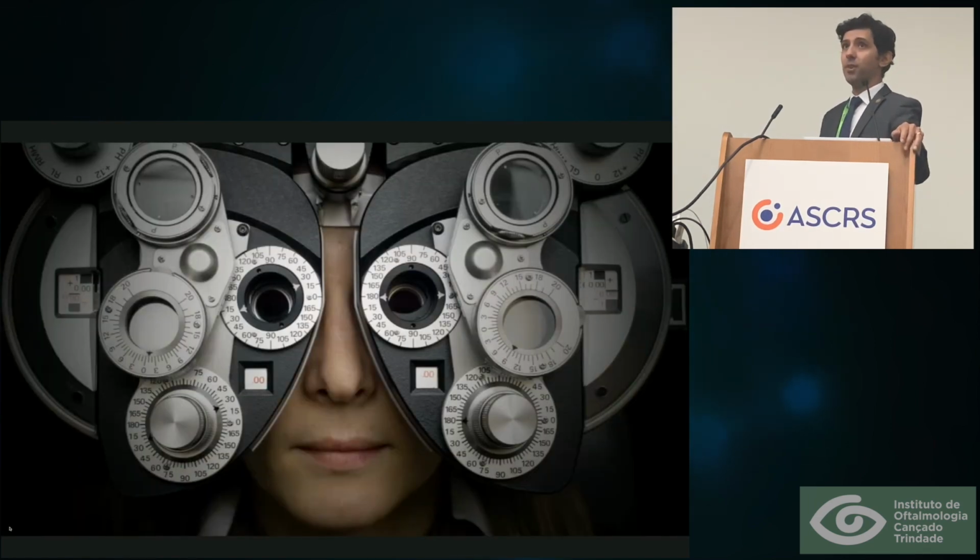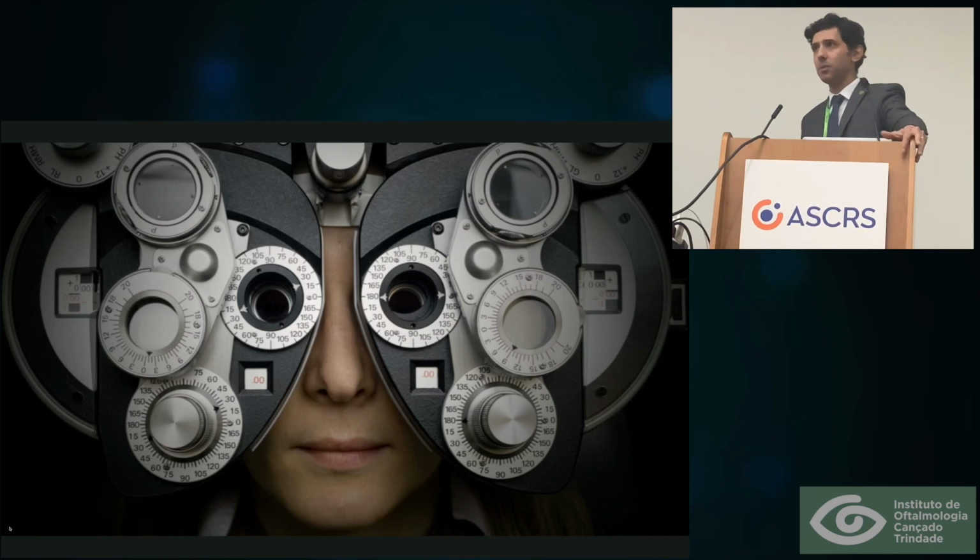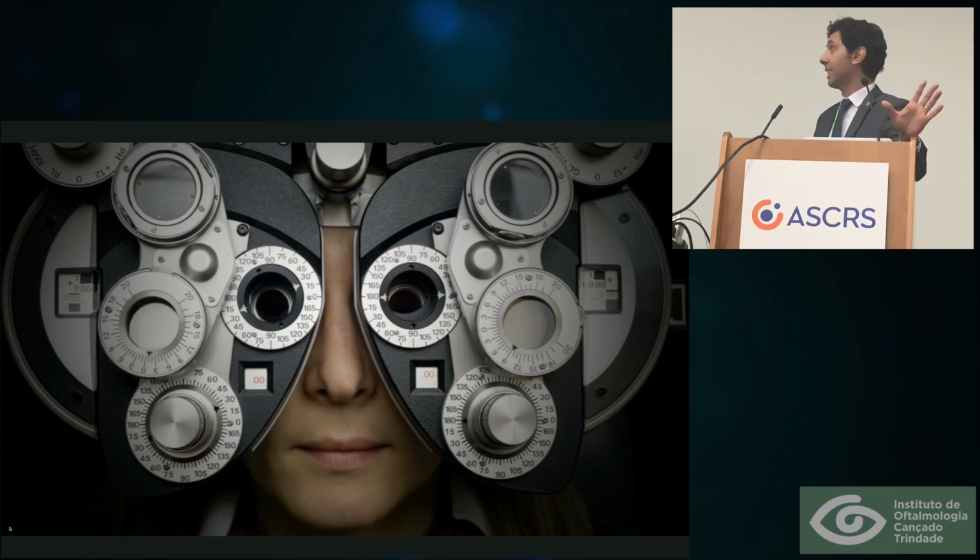So I'm sure some of you have witnessed this experience when we're trying to refract someone with irregular corneal astigmatism and we're having a hard time trying to find a decent refraction. And out of the blue, the patient says, oh, now I can see. And when you look up, there's a partial occlusion here of the lens, which is actually acting as a pinhole occluder. And that's when the patient gets excited and thinks that, oh, I want to do something like that. And you never find a correction that gives such a good vision.